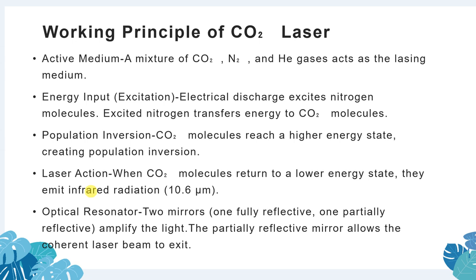In the previous slide I told about the He-Ne. Here the CO2 laser is the carbon dioxide laser, which is a high power laser that uses a gas mixture of these three as the active medium.